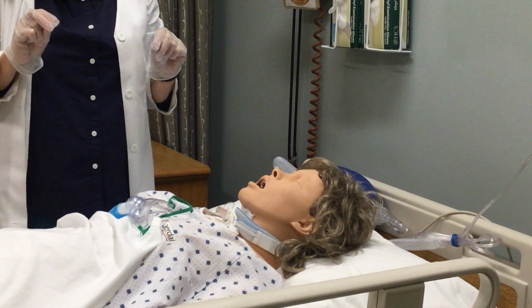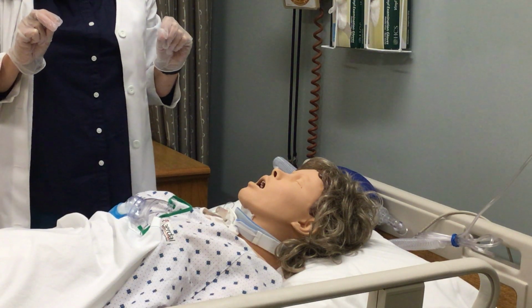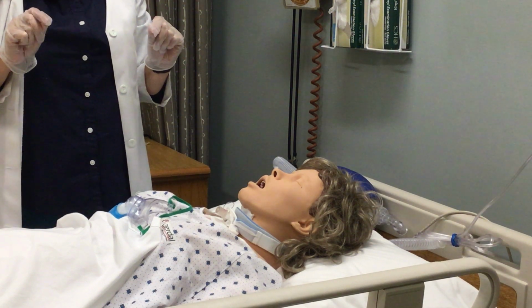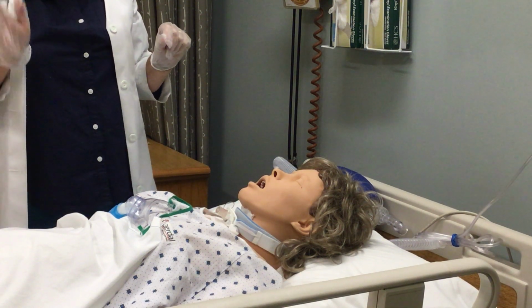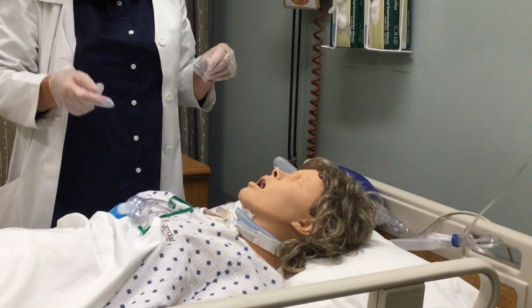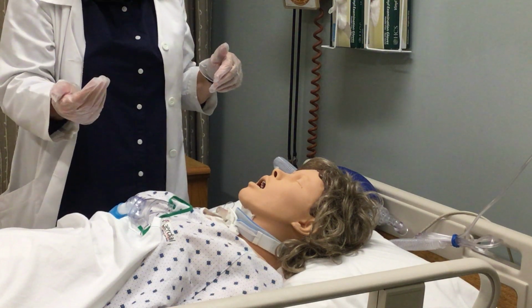Secure the tracheostomy using the tracheostomy tube holder method. Maintain a secure hold on the tracheostomy tube. Align the strap under the patient's neck. Make sure that the Velcro attachments are on either side of the tracheostomy tube. Generally, you get assistance with this part of the skill, but you don't usually want to take off one trach tie until the other one is in place because the patient can cough and dislodge it.